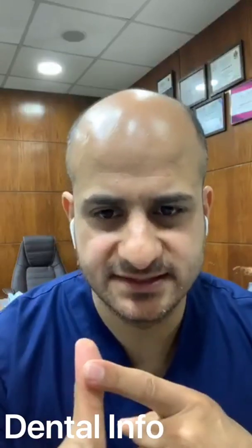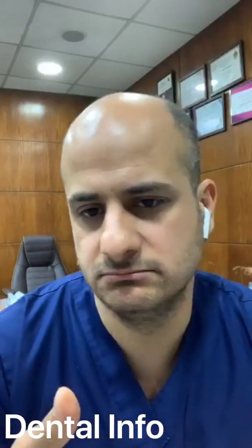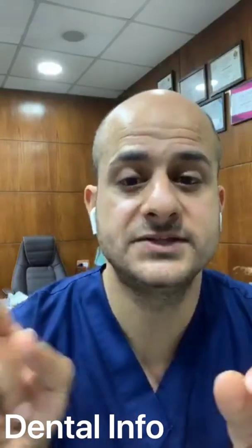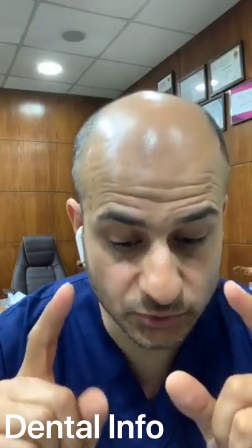Dear doctor, can you just repeat how you get the tugback? I will give you some tips. First, use less taper than your last file. So if, for example, you used 25.06, you have to take a 25.04 gutta percha cone. Check with your X-ray. Do not use large taper gutta percha because you may have tugback with a cone that does not fit, but this tugback is wrong, and this is a very important thing to notice.